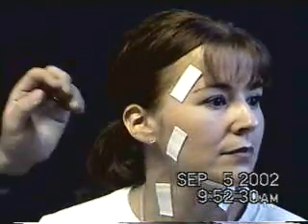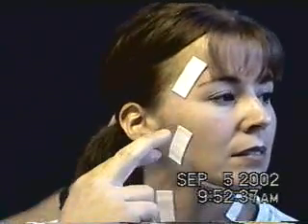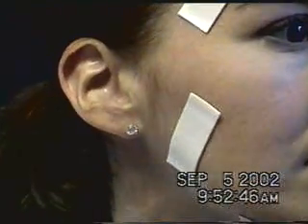With the masseter, I've palpated it here — please clench — and I can feel the masseter running right along this line, so I set the electrode here. The electrical contacts in the electrode, one here and one here, and we want to make sure those contacts run in line with the muscle fiber.